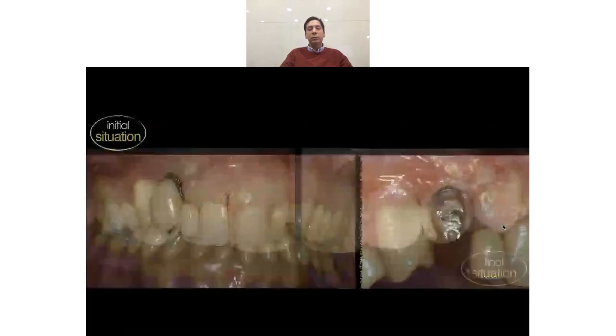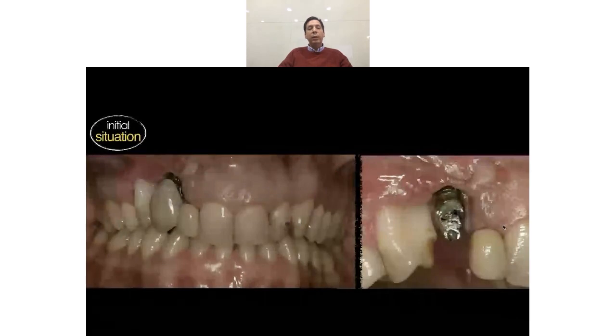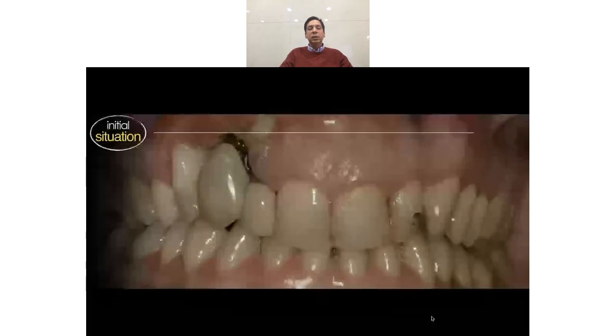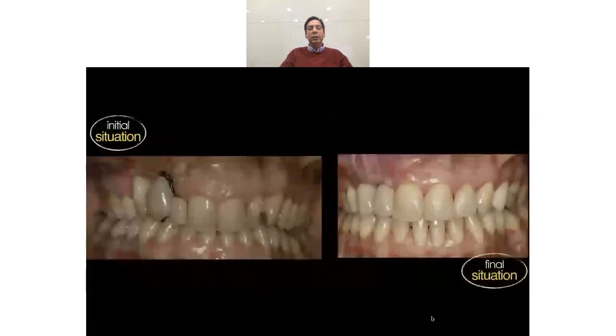lateral views. And remember, please, the starting point. We see the lack of symmetry. The right canine looks like the father of the normal, natural left canine. See the before. And see the final result.